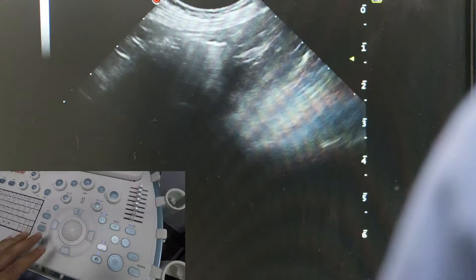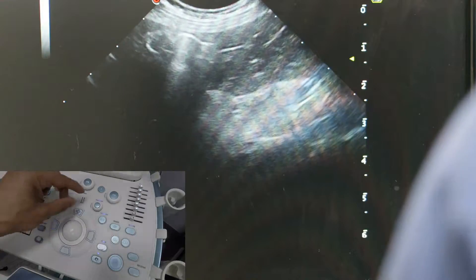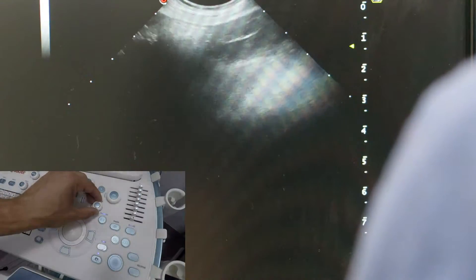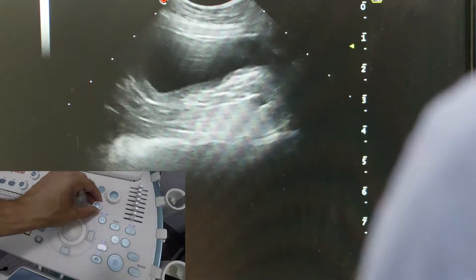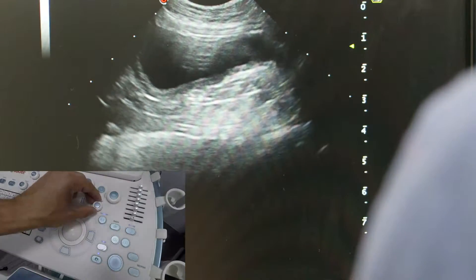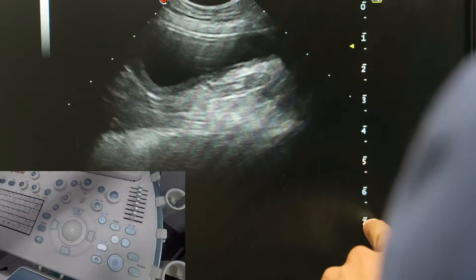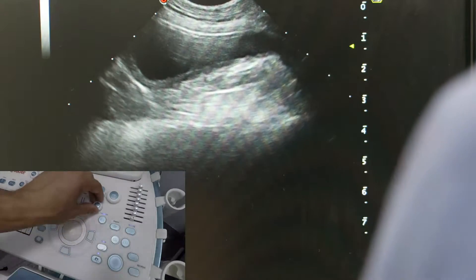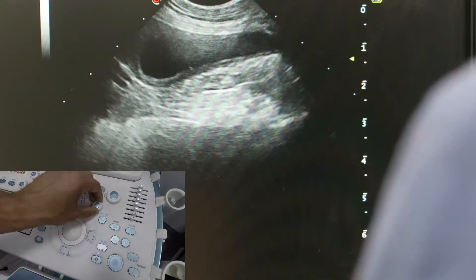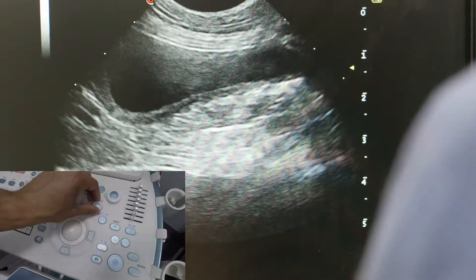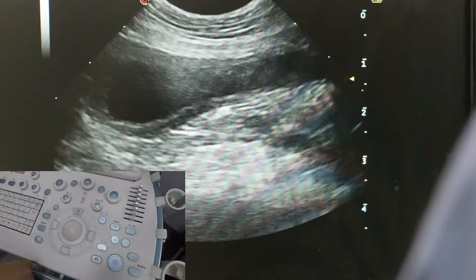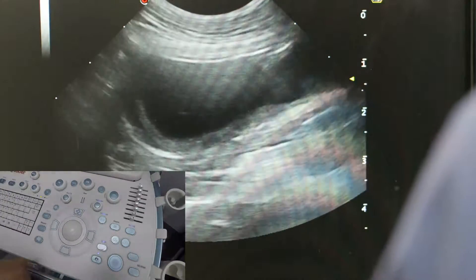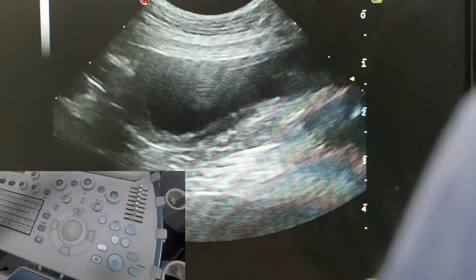There are three buttons I mainly use. The first is depth. If we're looking at the bladder, we don't need the depth all the way down to seven centimetres. Adjusting your depth so that what you're looking at fills most of the screen means we can now see the bladder in more detail.